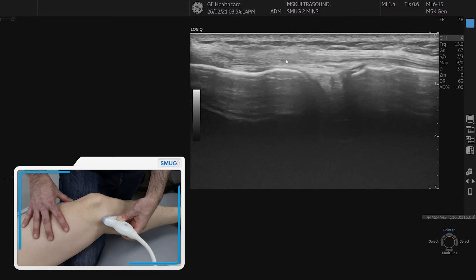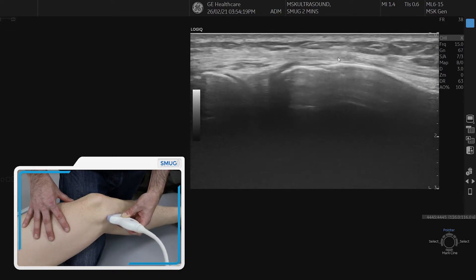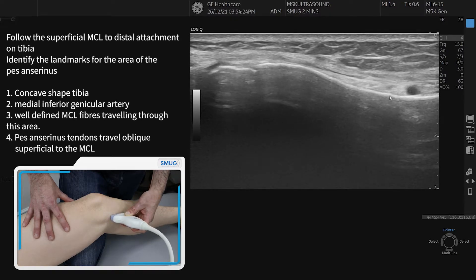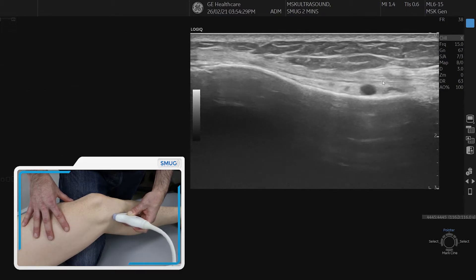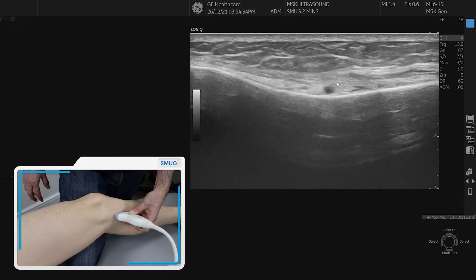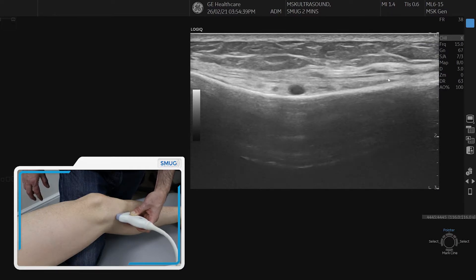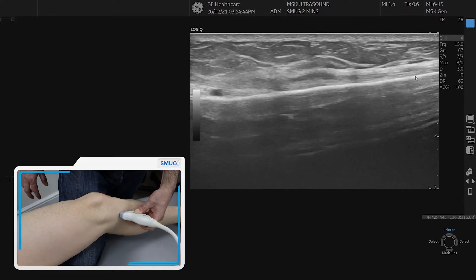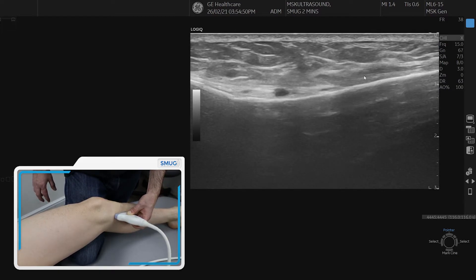Going back to the superficial layer of the MCL, we can follow it distally to the tibia. Drop it down and you can see the tibia has a concave shape — that's where the pes anserinus lives. The MCL goes through that area; you can also see the blood vessels as a marker, and on top of that the pes anserinus tendons going over it in an oblique way. The deep fibers of the MCL continue quite distally, finishing in the periosteum far down the tibia, so do follow it all the way to the attachment.